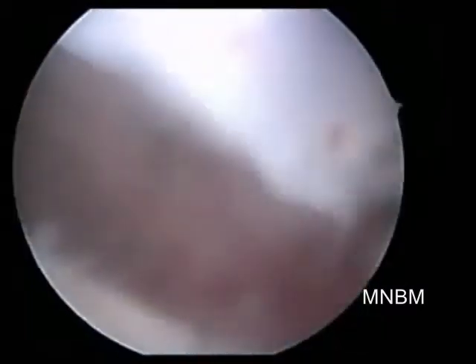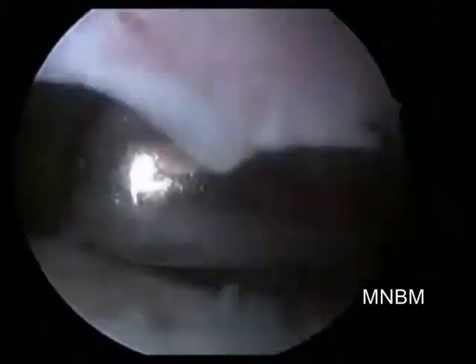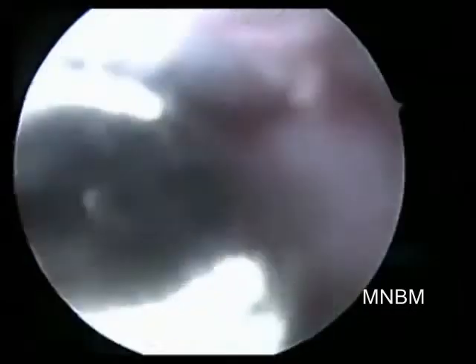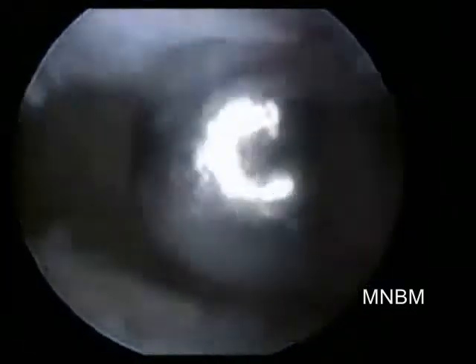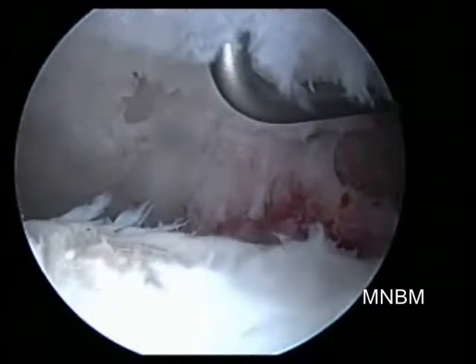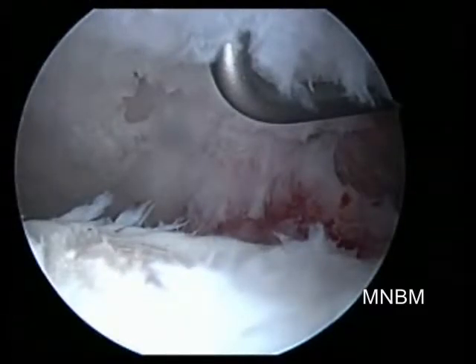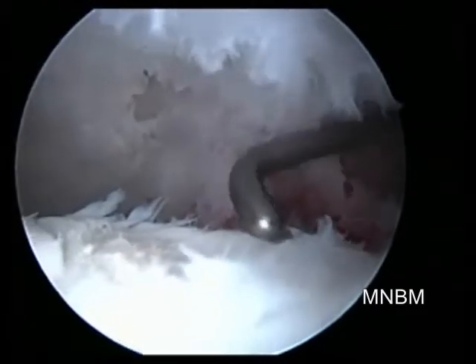The first instrument that comes in is the shaver, which takes off debris and part of the damaged labrum, improving the visualization space in the hip joint.